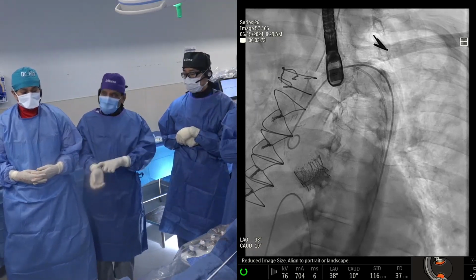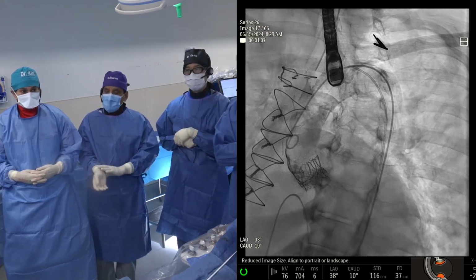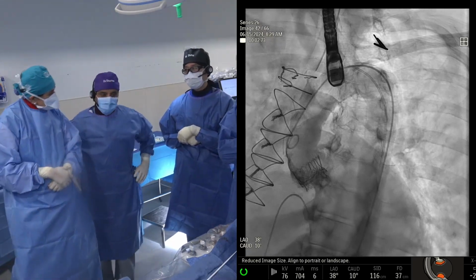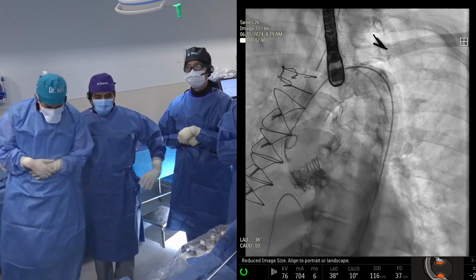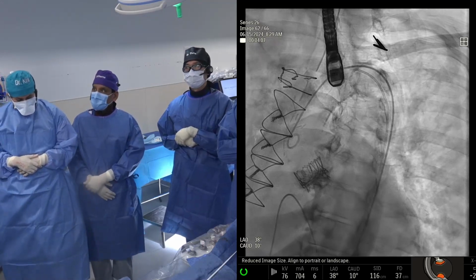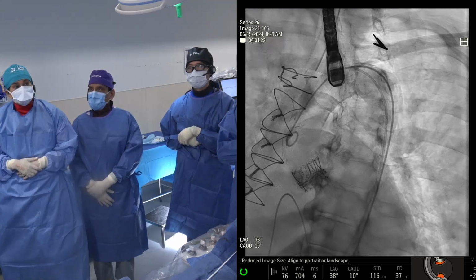Now this one was the right radial. One of the big reasons is that many patients have caths in there and the radials have gone, in about 10-12% of cases. We cannot put a Sentinel because the right radial is gone. But now with the new devices, Protembis and another new cerebral protection device, we thought this field was gone. The field is not gone. There are still about 3 new devices being tried at this time. And we will be starting a trial with the Protembis, which goes from the left side. So at least we have some option.